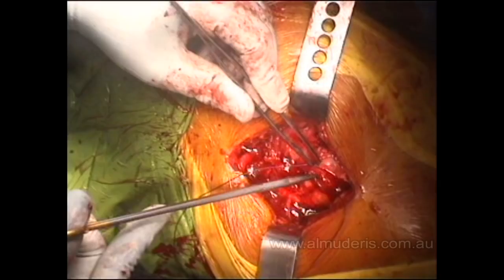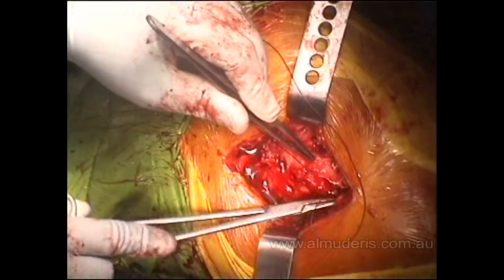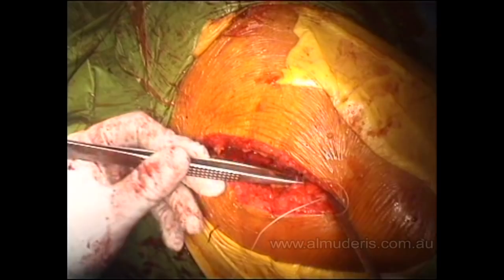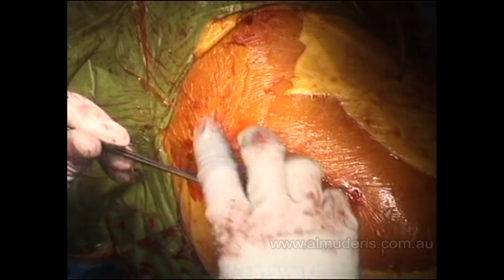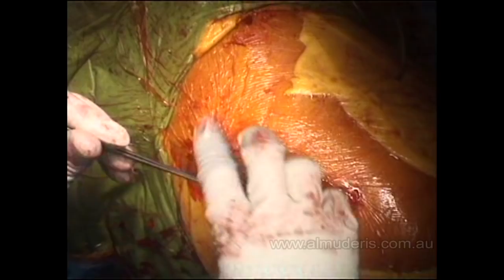The bursa is closed nicely, and that will provide insulation for the prosthesis from the rest of the wound — another layer that can decrease the chance of infection and provide vascularization for the hip joint region. Basically, any kind of repair restoring anatomy is helpful. You can see that although this is not minimally invasive surgery, the wound is very small at around 10 centimeters in length. Thank you very much.